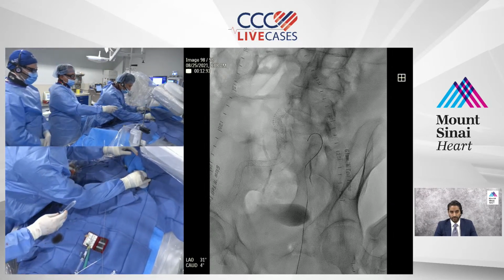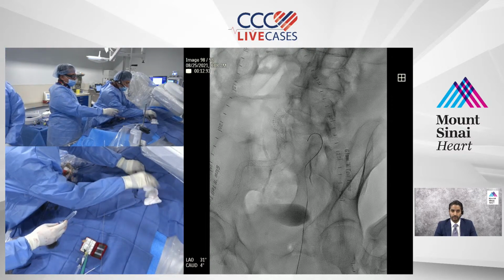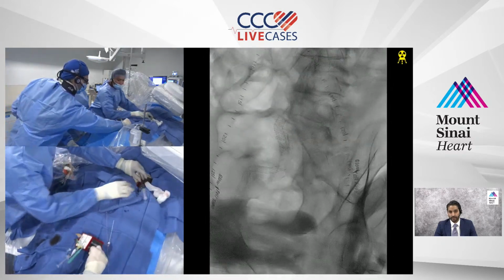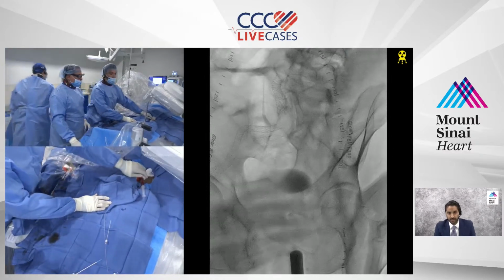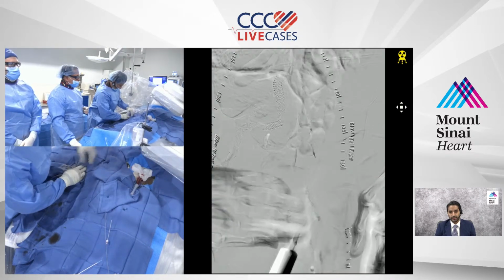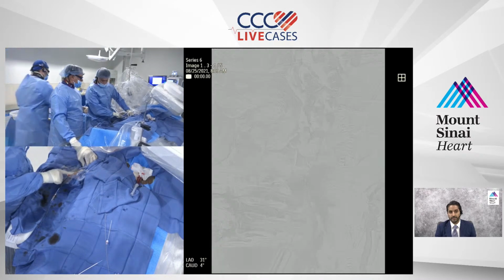It sounds as if you've really described the entire scenario. I think that the iliac tortuosity, the angulation, and the degree of disease is complex in itself. It's very sensitive. Another interesting part to this is that there is a lot further you have to take into consideration regarding the subsequent interventions, because he has such significant infrainguinal disease.